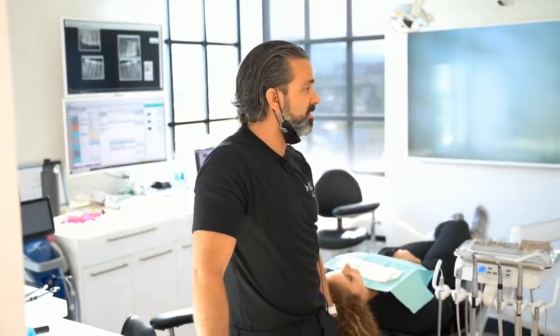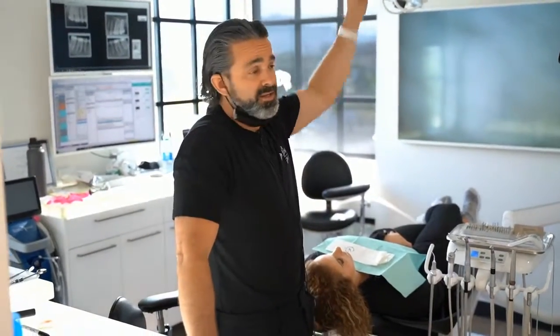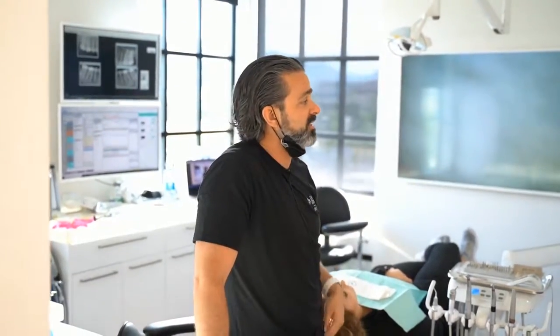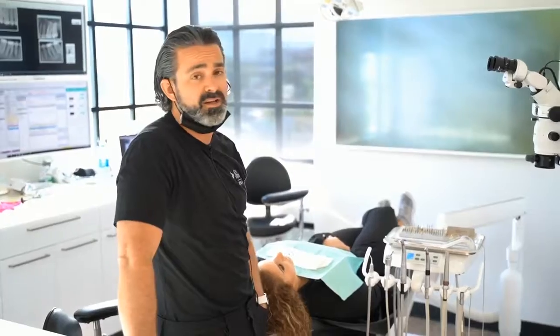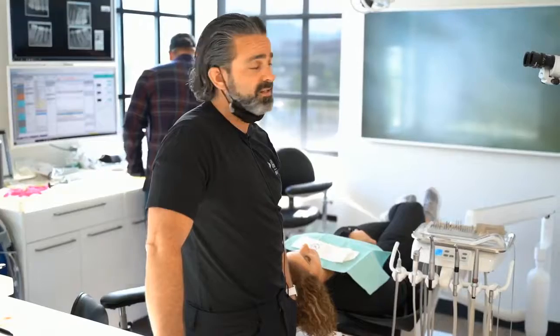The other thing is get dark glasses. You're probably already using them with overhead lights, but like I showed you, the light ring is different on a microscope. The heat difference is on a microscope. Overhead light is really high. And I've been through every generation. I remember the halogen light bulb, and then xenon light was the next greatest craze, and now it's up to LEDs. LEDs are efficient but bright and do generate heat. The xenon really generated heat, so definitely stick with an LED light for sure.